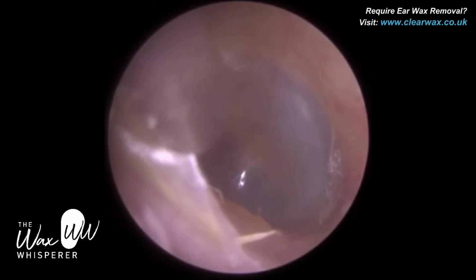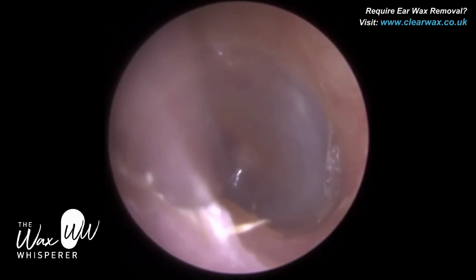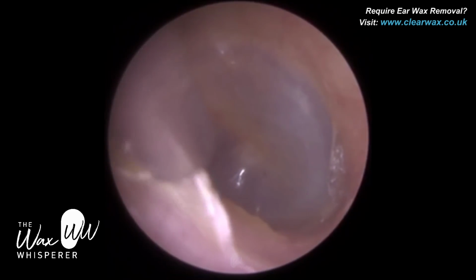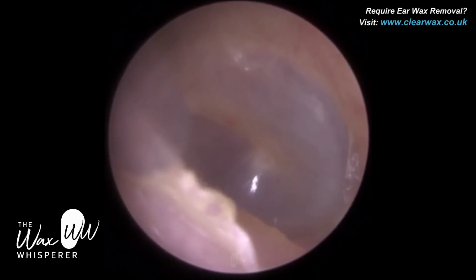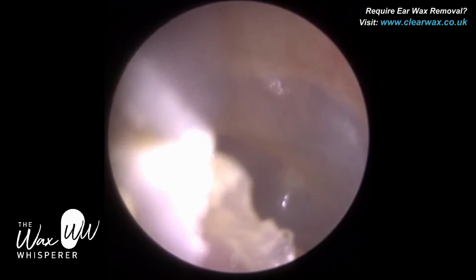So we're just on the anterior canal wall. This is the front part of the ear canal. And again, the skin is very tightly adhered, so that's why you can't always remove it. It's a dead layer of skin, and this skin is trying to come out naturally. It's migrating sideways, but yes, it's very tightly adhered.